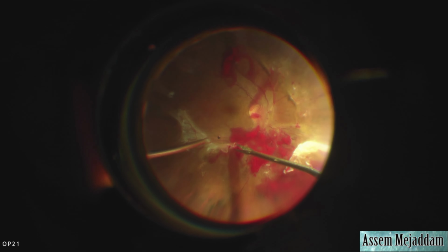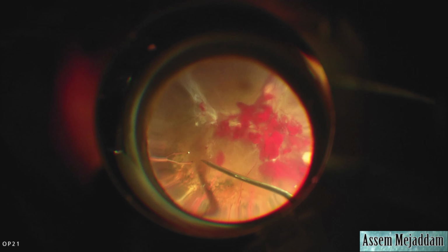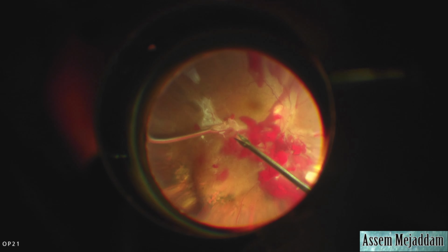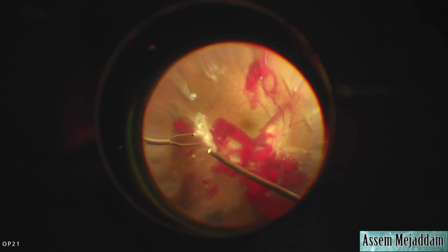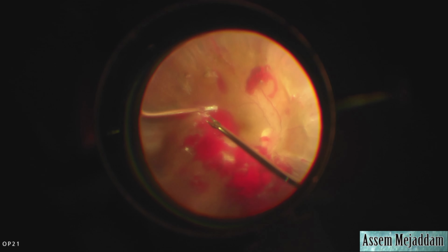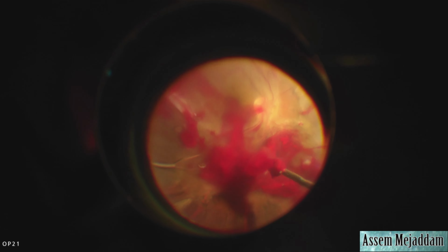The patient does bleed very easily, despite having been given anti-VEGF therapy just days prior to the surgery. And so generally I try to be slightly cautious with diathermy use. I don't want to be too keen on using it early on unless I definitely need to. However, after some time, it's just not possible because the retina is not visible enough to work on. Temporarily raising the IOP will also work very well as a hemostatic technique.